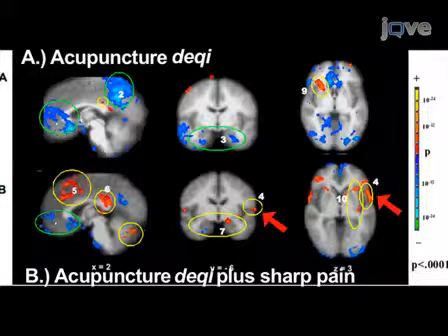With pain, activation of the sensory motor and association cortices became more prominent, and a subset of the limbic regions, such as the middle cingulate, supplemental motor area, posterior cingulate BA23, amygdala, and cerebellar vermis became activated. Activation of the insula in de qi was localized to the right anterior division, while activation in pain did not show specific localizations.